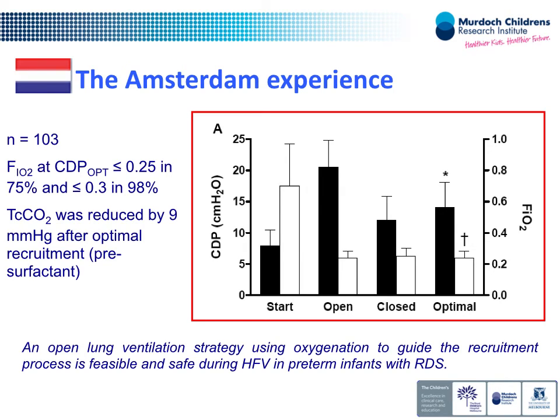At the end of the day, at least physiologically, if you look at the pressure-volume relationship and the way the lung behaves at an alveolar level, having the lowest pressure that maintains recruitment will give you less shear force movement in the lung and maintain an end expiratory volume in the alveolus. So it should be theoretically the most lung protective. We don't have an RCT of this with lung injury as an outcome. It would probably be unethical to do that to a certain degree.